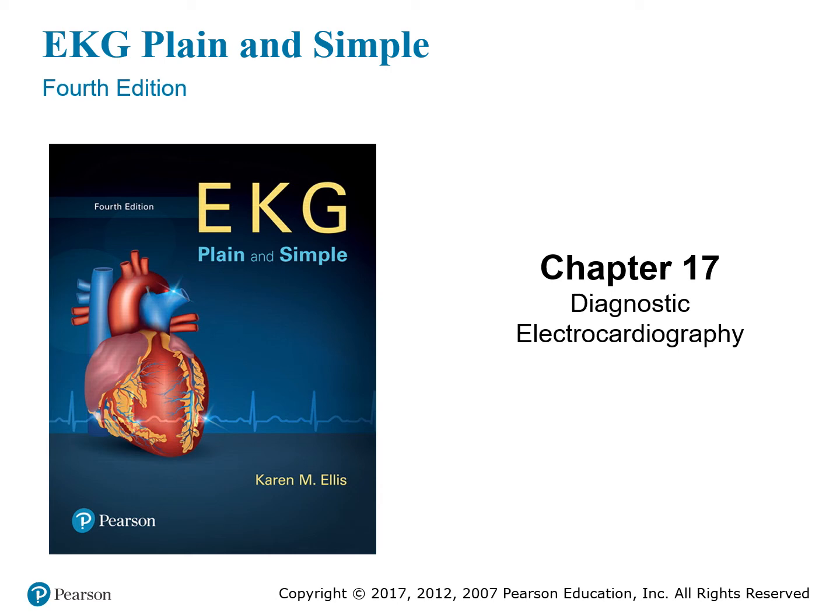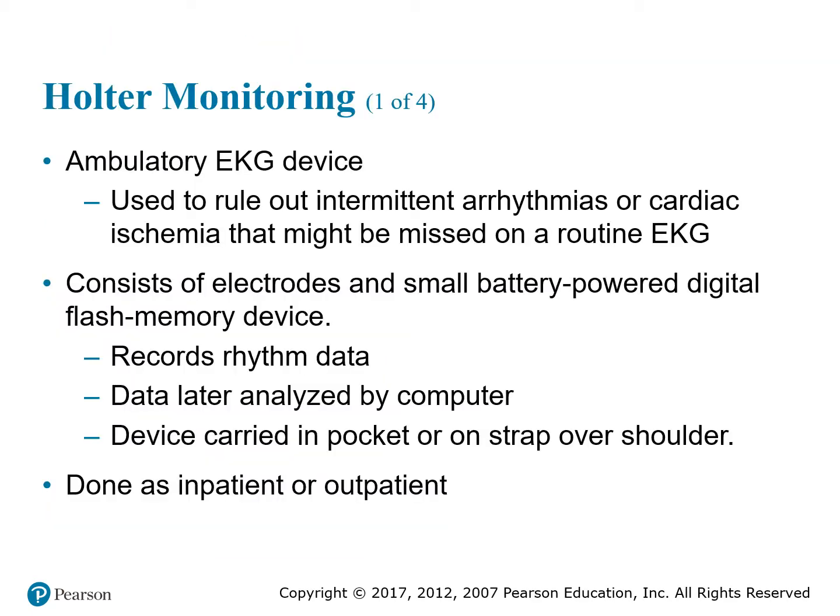Welcome class to chapter 17, diagnostic electrocardiography. This is the last lecture of this chapter where we will be discussing Holter monitors or Holter monitoring. Holter monitoring is the process of recording an EKG tracing from an extended period of time while a patient goes through his or her daily activity.